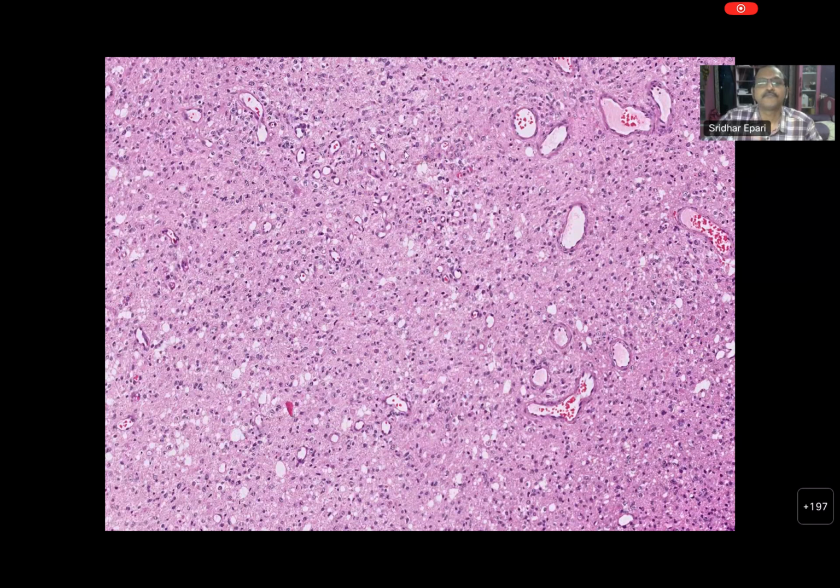We're not seeing mitosis, but are there any additional features in this slide? Vascular. There is an increased number of vascular channels, right? So is this a feature for microvascular proliferation? No, sir. Anybody, Anita? No, sir. Abhinami says no. Anita? No. Shreya? No, sir. Why? Can Anita say why this is not microvascular proliferation?